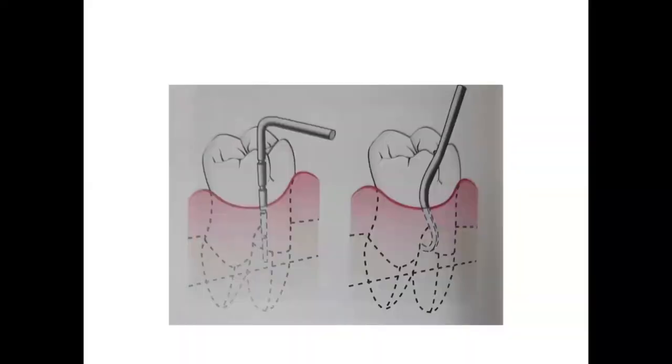And the last is furcation involvement. In furcation involvement, you have to take into care both the vertical and the horizontal axis of the furcation. The vertical is to be noted with the normal probes, while the angulated part can be used with curved probes like Nabers probe.